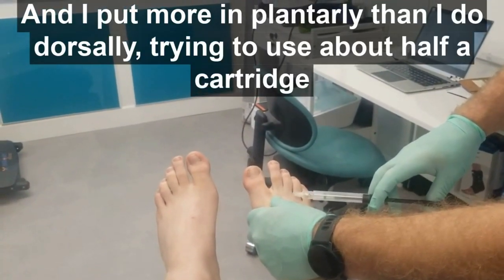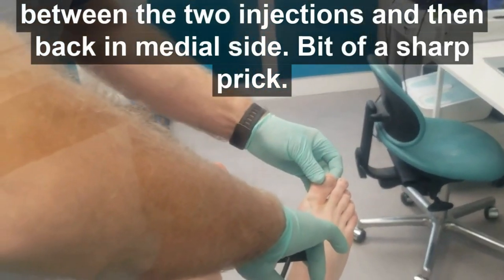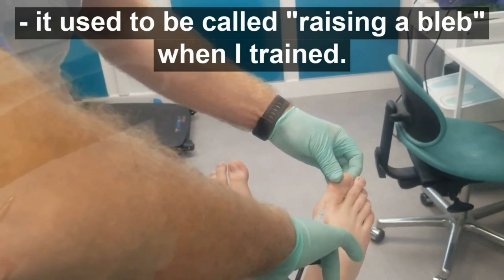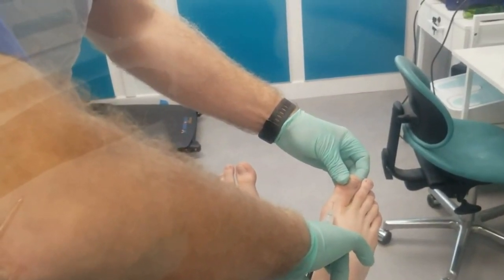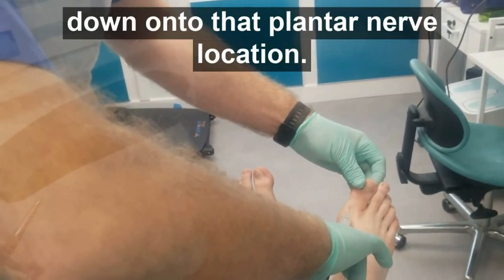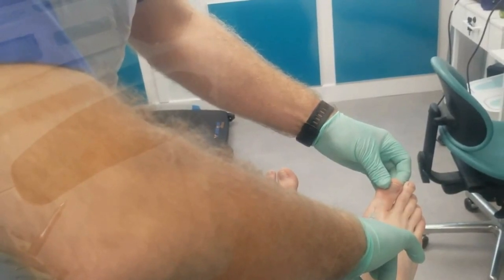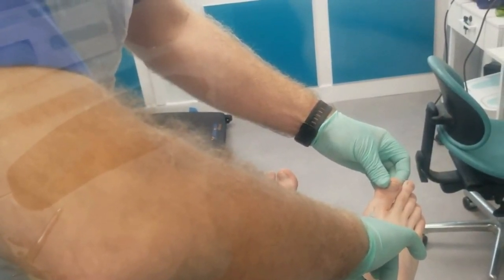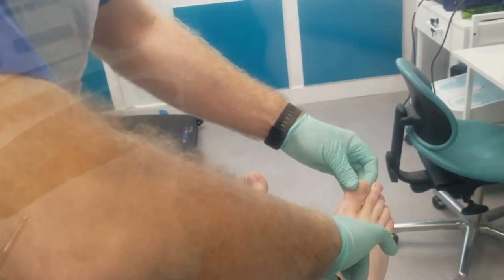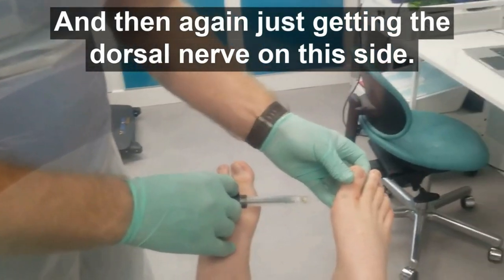I've injected more plantarly than dorsally, trying to use half the cartridge between the two injections. Then back in on the medial side, injecting just at that injection site — slowly injecting down onto that plantar nerve location. Taking it nice and steady for the patient so it's not too uncomfortable, then getting the dorsal nerve on this side.